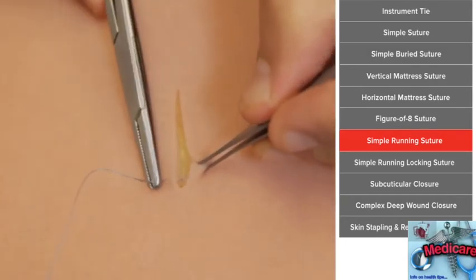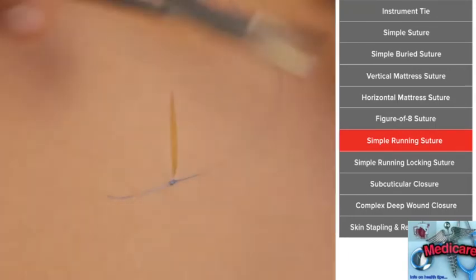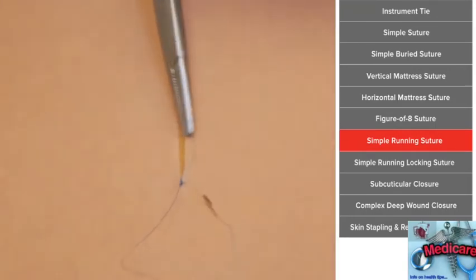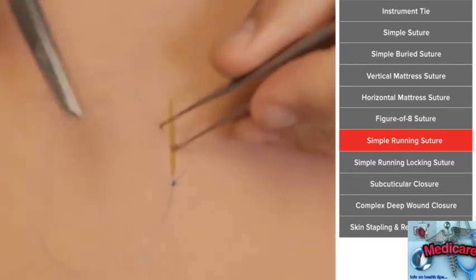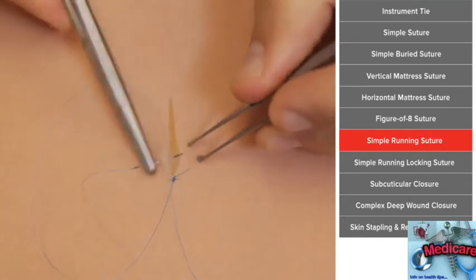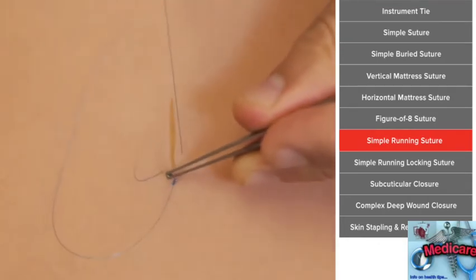So this is just a simple suture. You'll tie your first one with your instrument tie. Keep the length of your suture long enough for the job, but not so long that your hands are going all over the place. Now we're going to reload, and move along the same distance each time. Even though when we tie the stitch it looks like it's closer to the skin, we need to enter the skin exactly the same place.